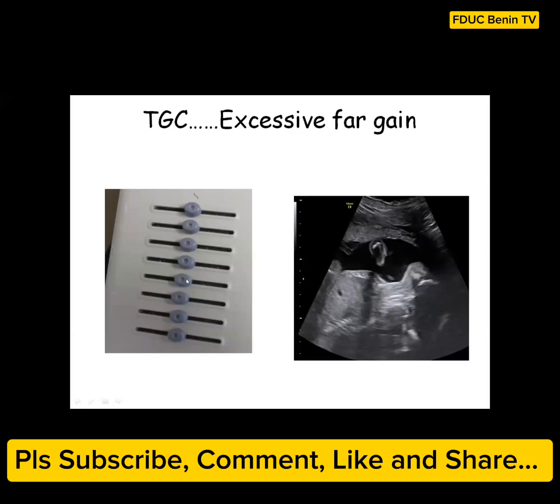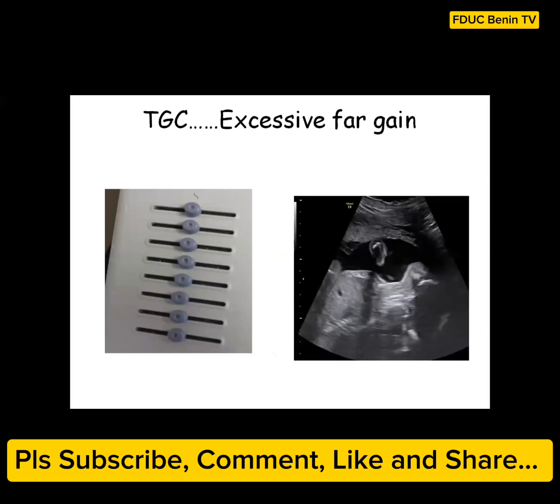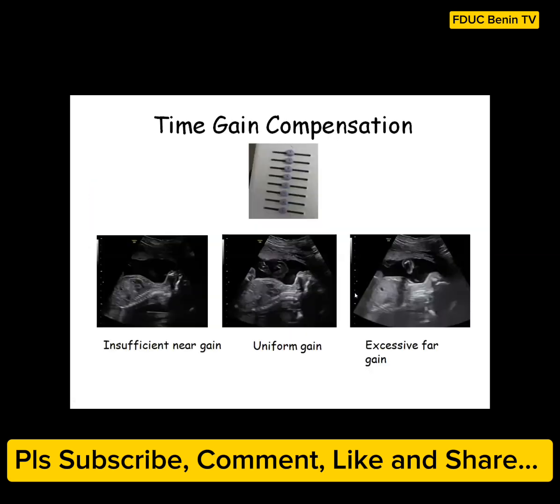Each of these knobs corresponds to different depths of the area of study, and you can use it to adjust the brightness of a specific area. The ideal thing is to make sure that the brightness is uniform all through. But when you want to study a particular area, you reduce or increase the TGC that corresponds to that depth.